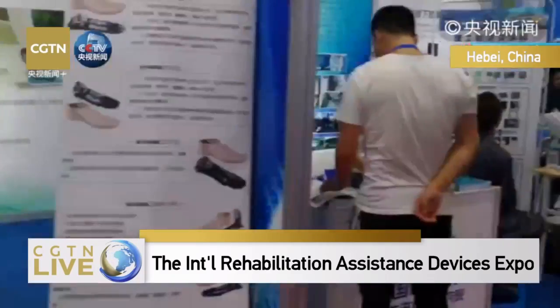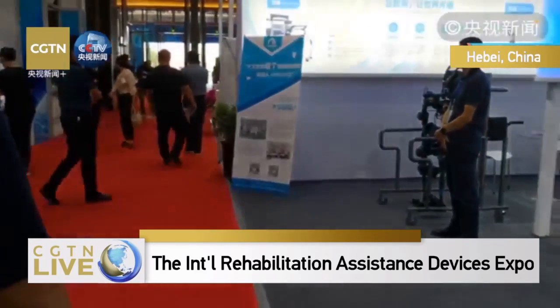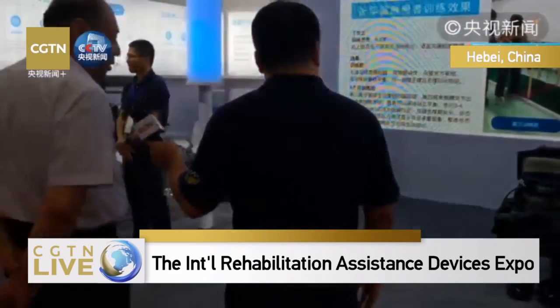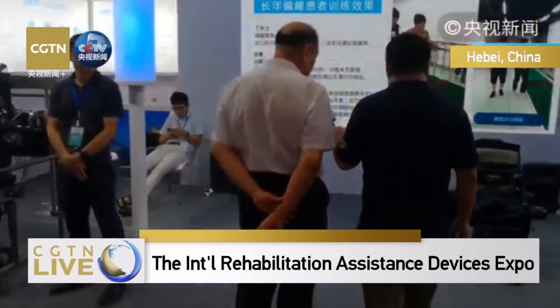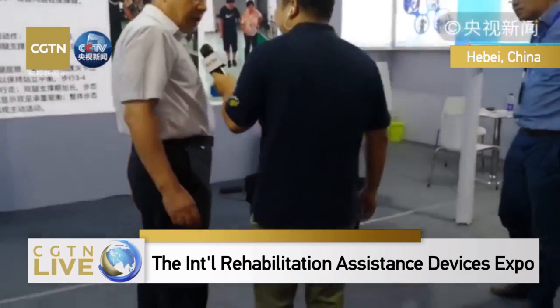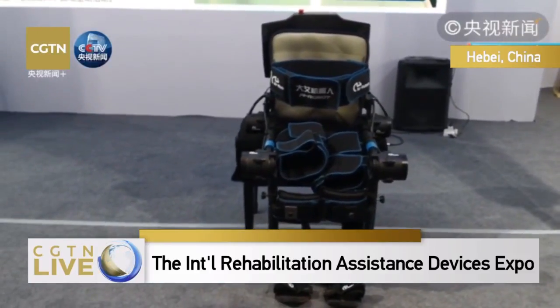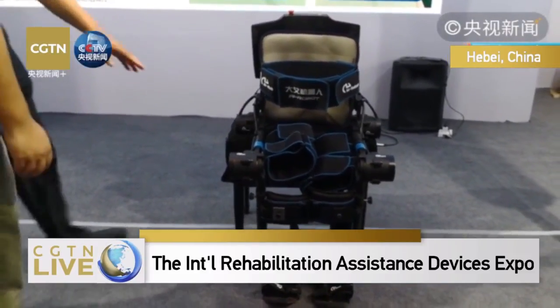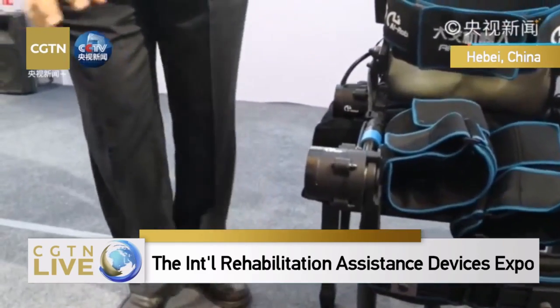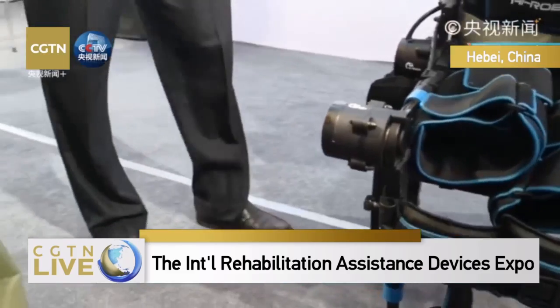Just now we were making introductions of the research results of the research institutes and universities. This is another exoskeleton robot aiming to help those paralysis or partial paraplegic patients. So this is with motor. The external powers are exerted on the knee and the feet.